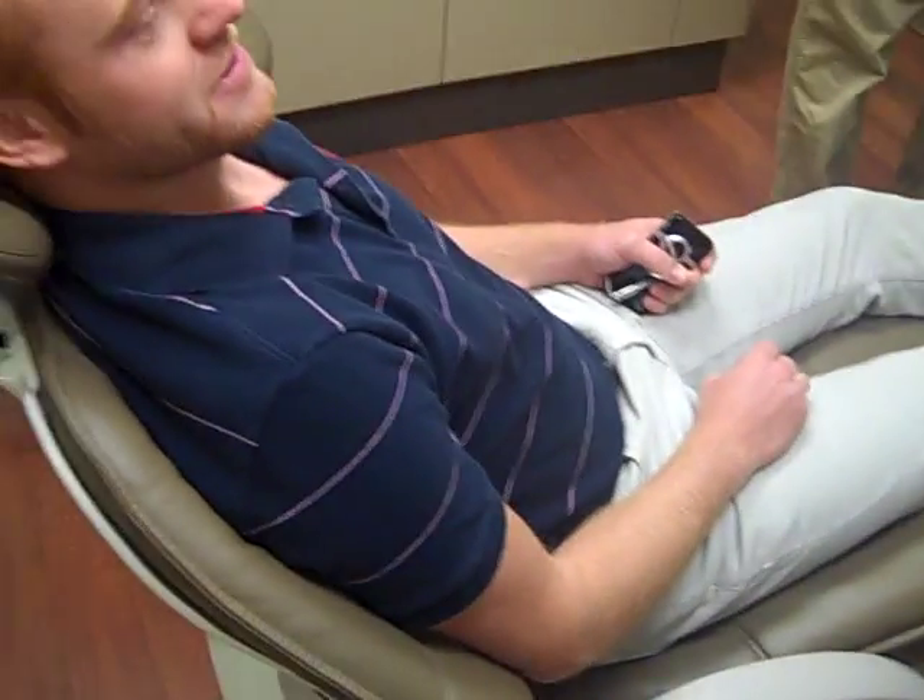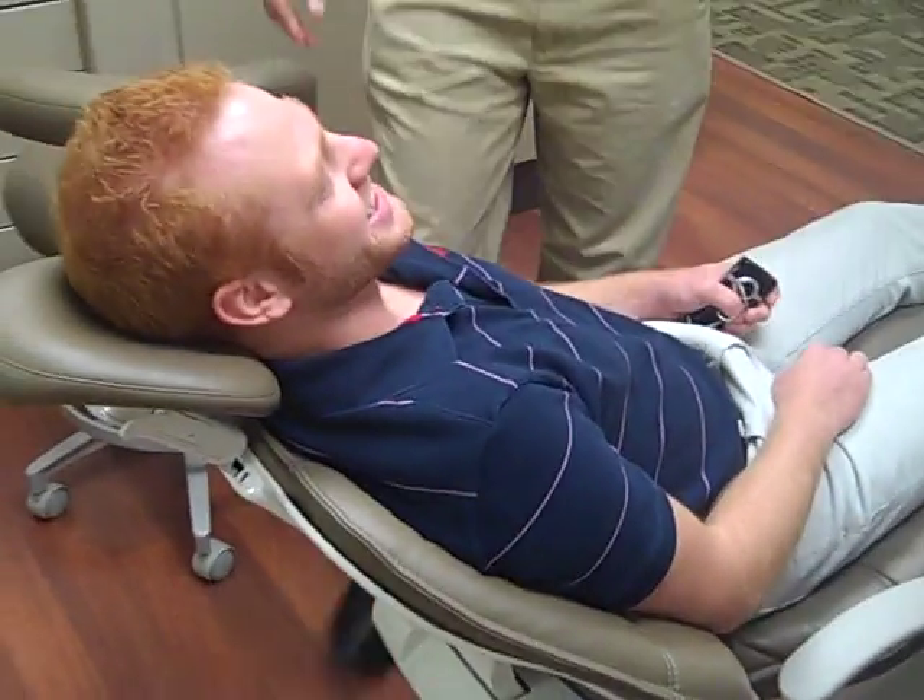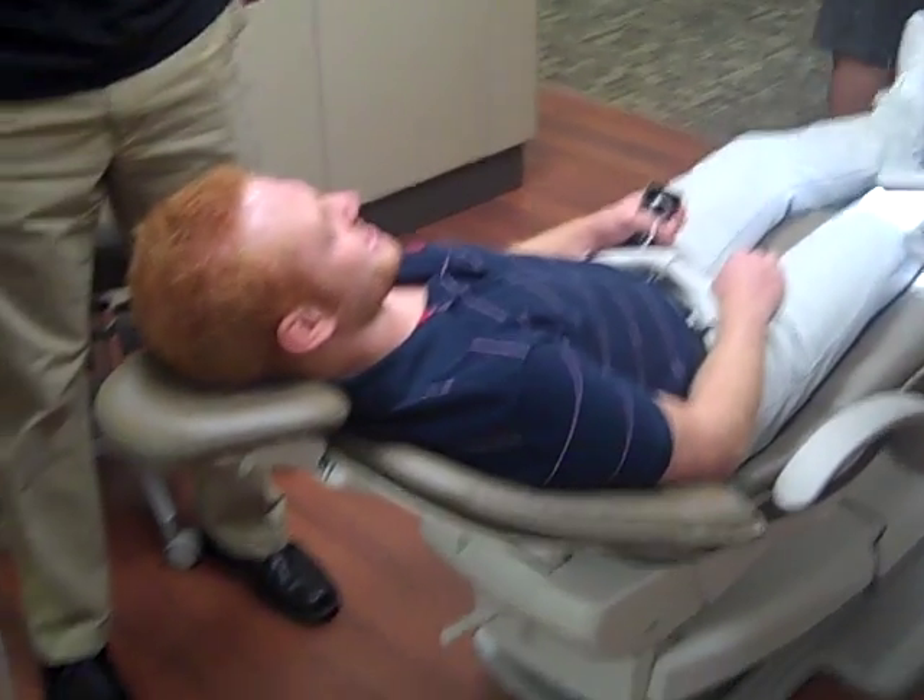Have a seat. Okay, doctor. Let me give you a... Where's the chair? Let's give you a recline. I reclined it. Let's get a burr. Get the nitrous.